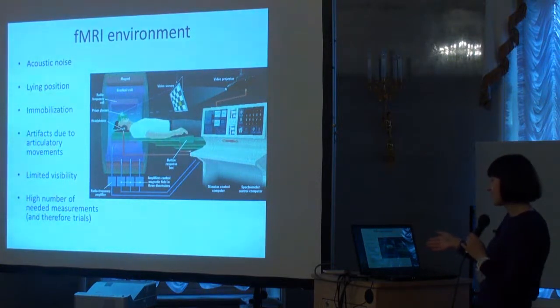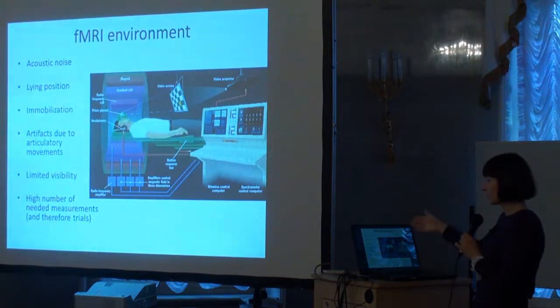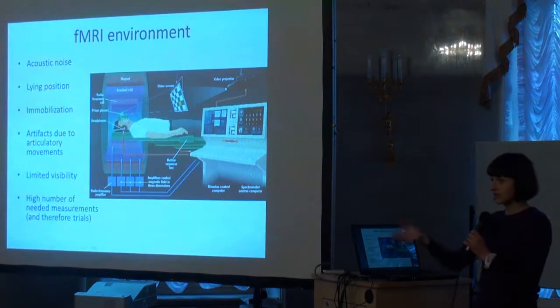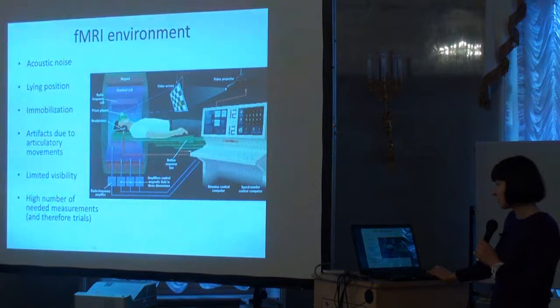And because of the lying position and because the head should be in the scanner, we use a sophisticated set of mirrors to deliver visual stimuli, for example. And this is not very convenient for a participant. And actually, there is limited visibility.